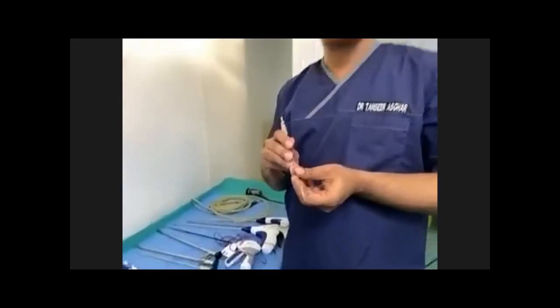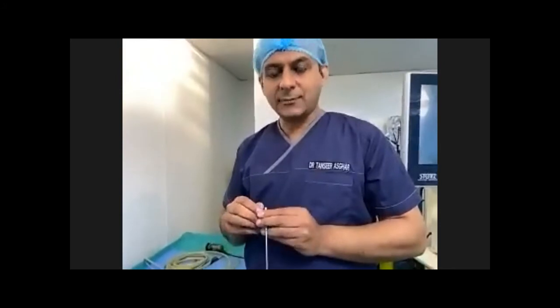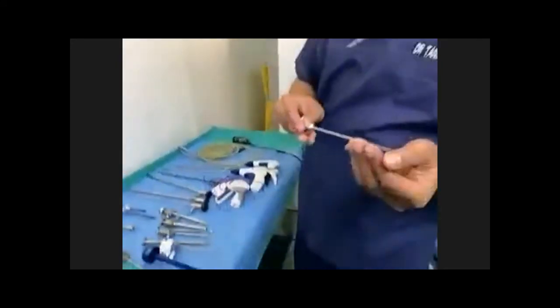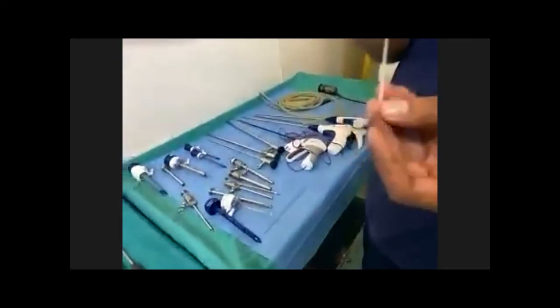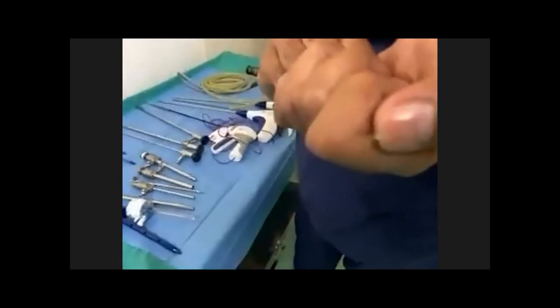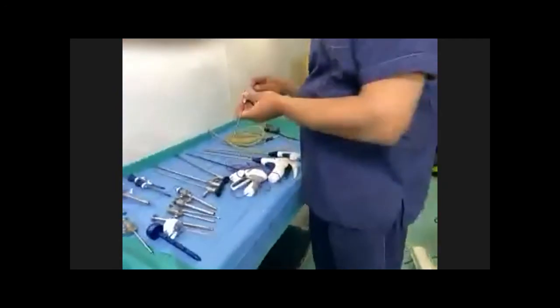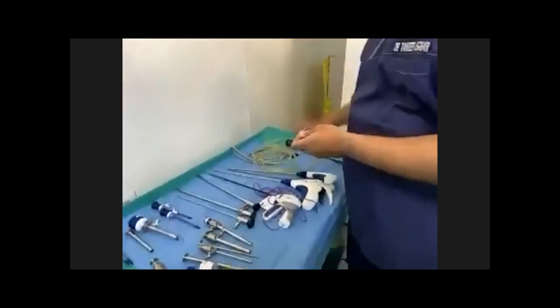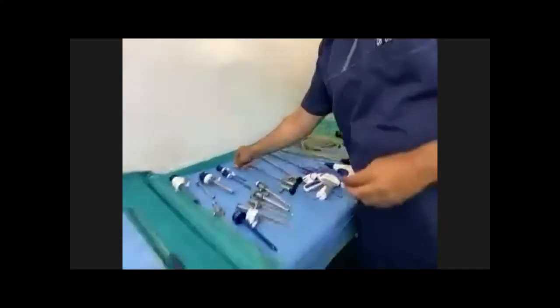This is the Veress needle. This is a special type of needle which gives you access to the abdominal cavity. When you study access, it will be told in more detail. For now, it has a blunt end. When you go in, it automatically saves the, you know, it has a sharp end. If you can see, when you go in, this blunt end will come out. And you will attach a gas pipe over it, right? So this is an important instrument.